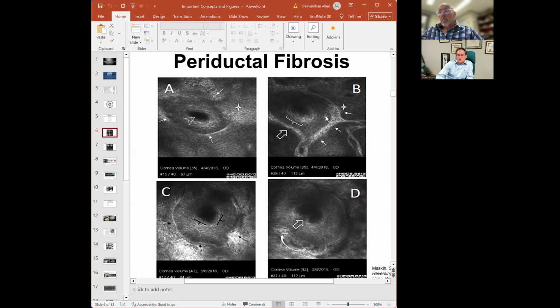In B, as we travel deeper into the same gland as A, we find that the scar tissue is now organized as a tight belt encircling the gland and choking it off. You can see how the lumen is now collapsing. In image C, at 4 o'clock, again, an area of scar tissue is pinching in on the duct wall.